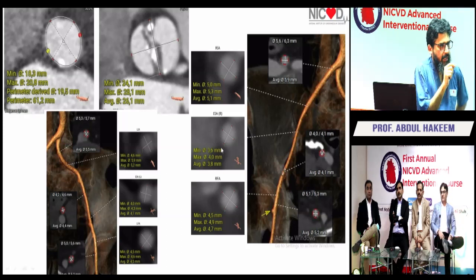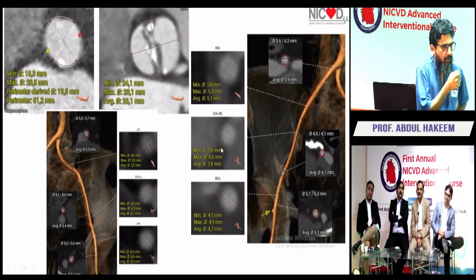Sometimes one foot plate is against the posterior wall. So you take one bite of the anterior wall and one off the posterior wall. And you can't tell right away because you've not tightened the knot. Now, at the conclusion of the procedure, when you pull the sheath out, you tighten the knots. So you've literally taken a bite from the posterior wall and you close the artery.